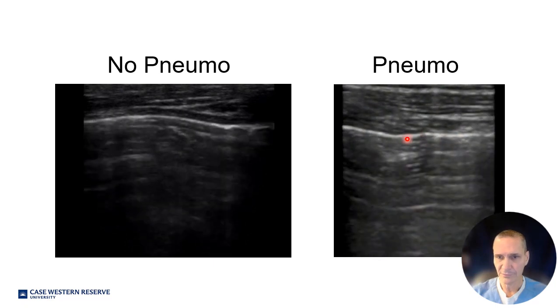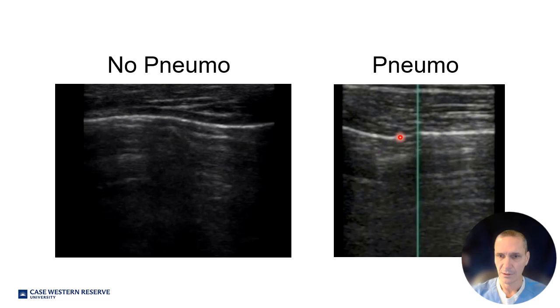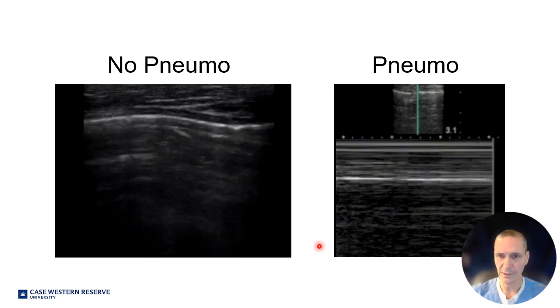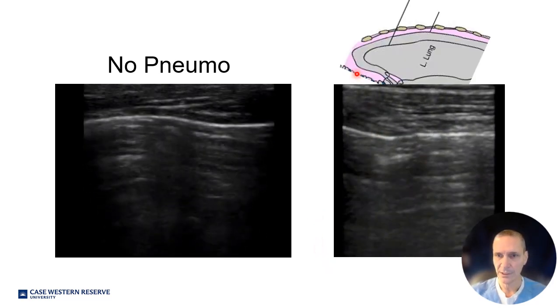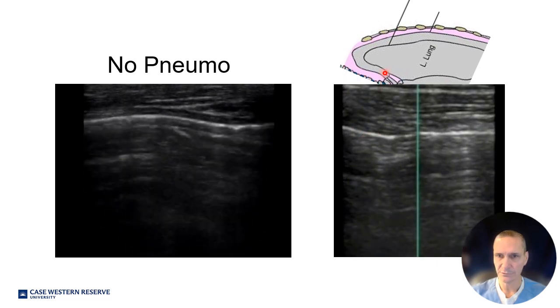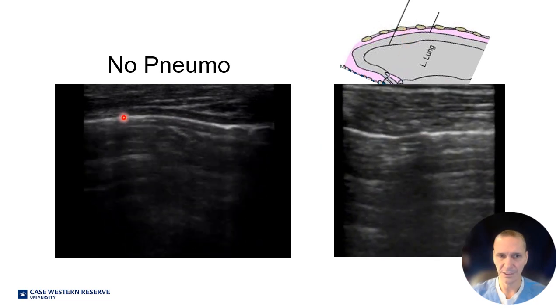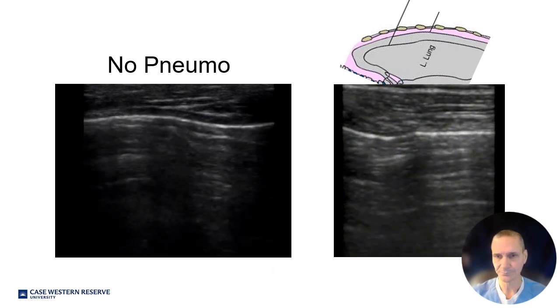This is live. Remember 2D mode here, and then you're going to see they are putting this into M mode, and this is motion over time, and we'll talk about the findings you'll see there. So again, on this, when the lung is down or presumed to be down, the parietal and visceral pleura won't be together, so you're not going to see lung sliding.